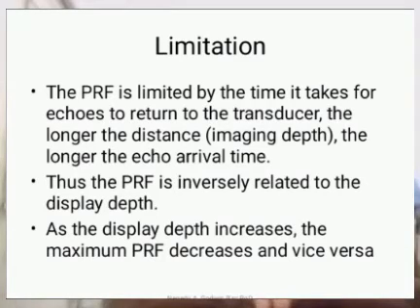So what are the limitations to this PRF? PRF is limited by the time it takes for echoes to return to the transducer. The longer the distance, that is the depths, the longer the echo arrival time. Thus, the PRF is inversely related to the display depths, just like I mentioned in the other slide.